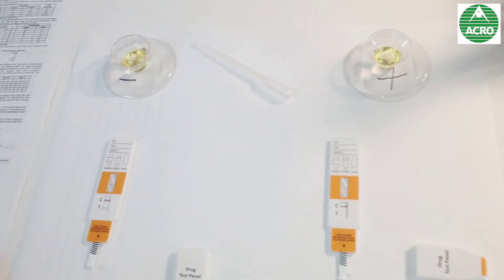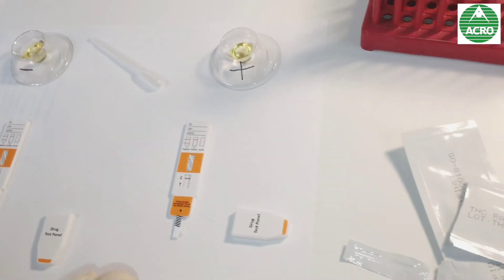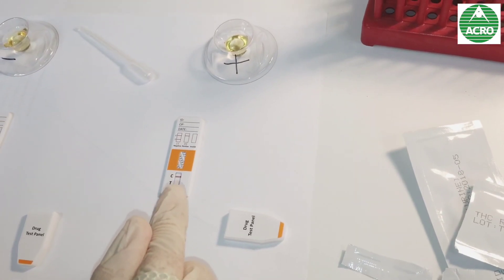So in the negative urine, we can see both lines, the testing and the control line. But in the positive one, we can only see the control line and not the testing. That means indeed he was high yesterday night. Say no to drugs.